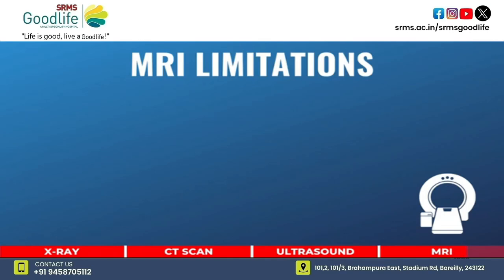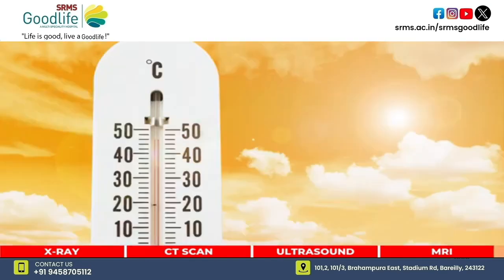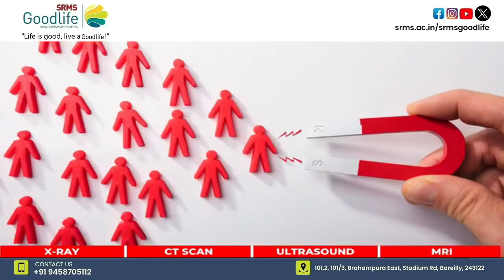MRI has many limitations. It takes a lot longer to perform. It is relatively expensive, and it cannot be performed in people with certain metal implants, as some metals can heat up or be attracted to the magnet.